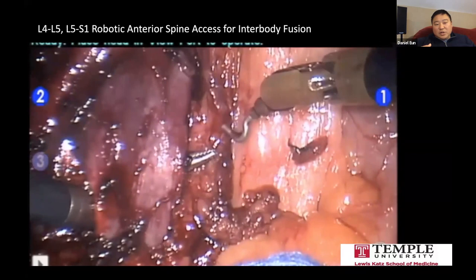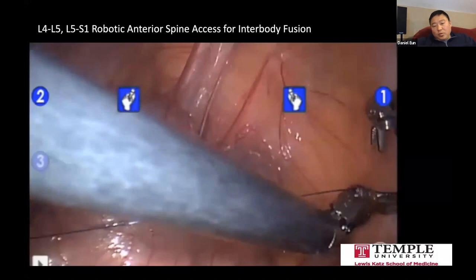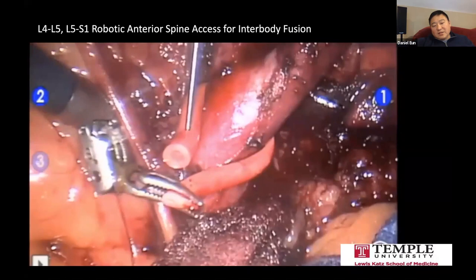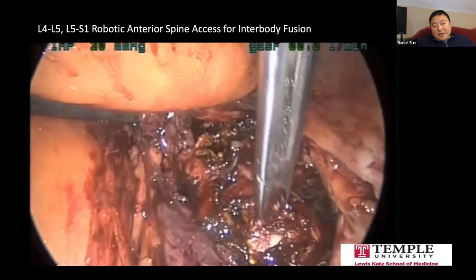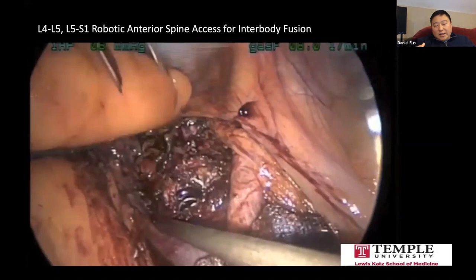This is a terribly risky operation. You can see we're putting these red rubbers around the vena cava and aorta, and we're going to pull them. My assistant at bedside is going to pull these red rubbers to part the two great vessels, so that we can put heavy drilling equipment down onto the spine. As difficult and spectacular as this type of procedure may be, what I realized from this work was that it was so complicated and so risky that it may be reproduced by only one or two people. This is not really doable and not reproducible by our field or by the masses.